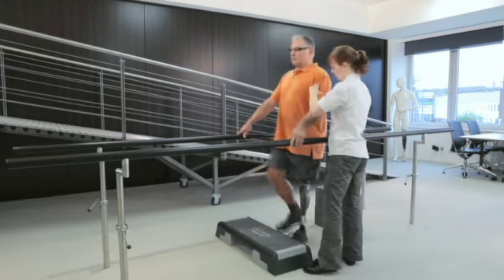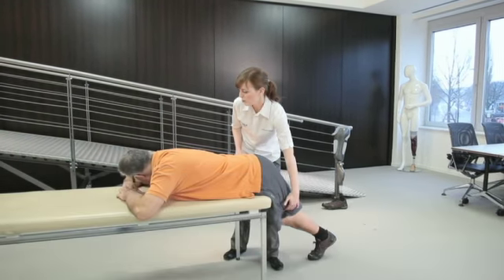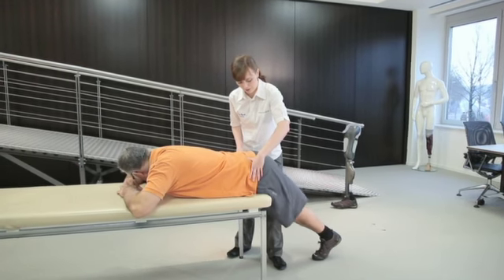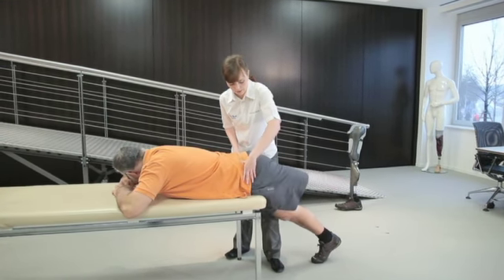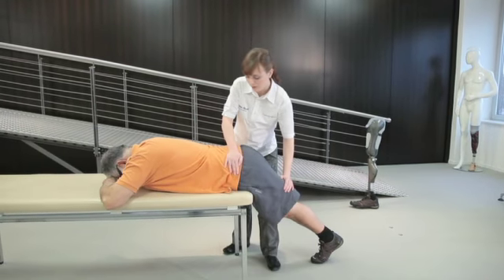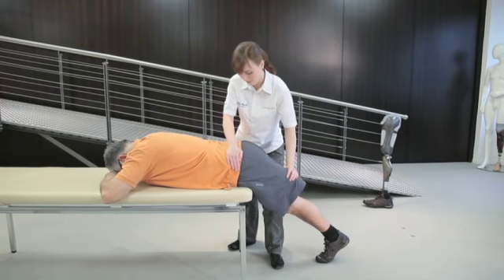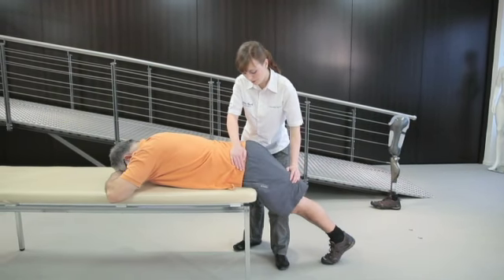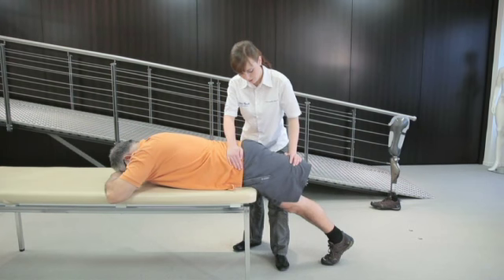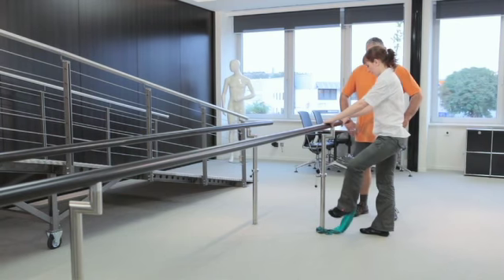Because the hip extensors of prosthesis users are often not that strong, it may be helpful to integrate hip extensor strength training exercises into the user's training programs to maximize the benefits of the Genium. A first exercise can be done without the prosthesis. The user should lie on his stomach, with you as the therapist standing behind the table. Lay one hand on the residual limb and the other hand on the pelvis and increase resistance while the user extends his residual limb.